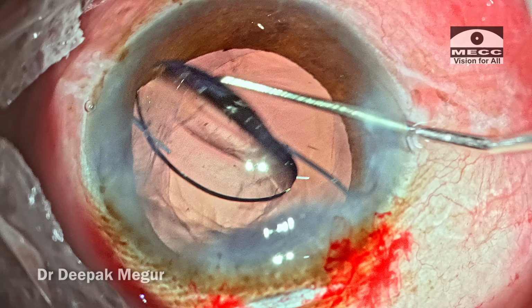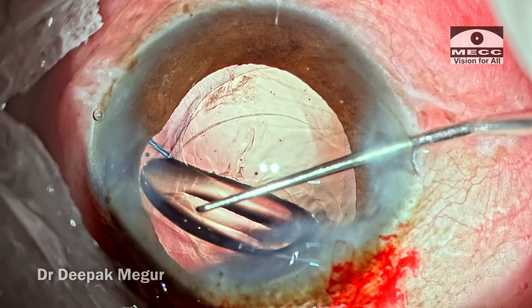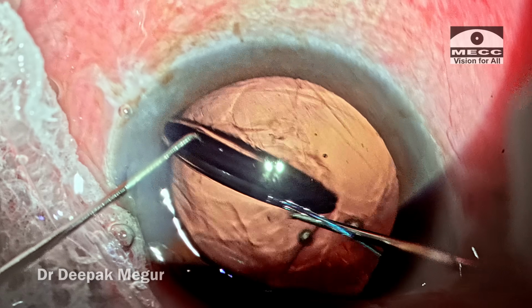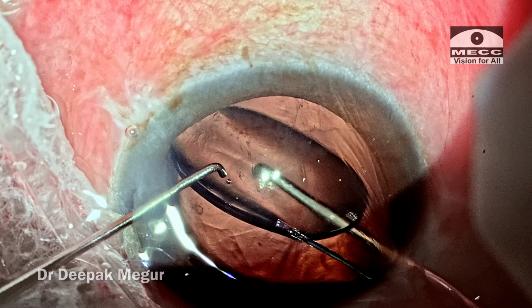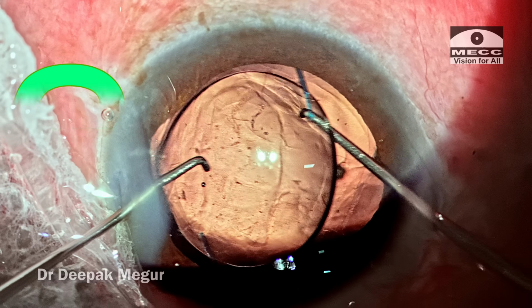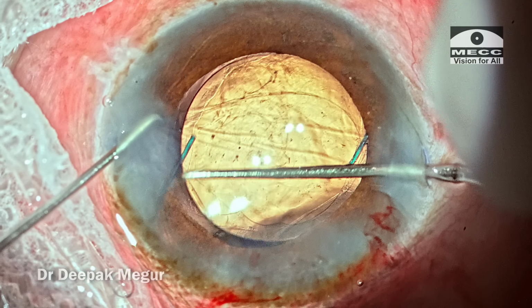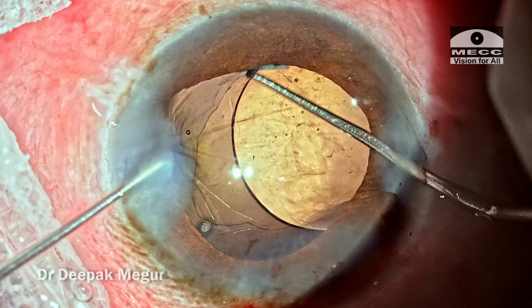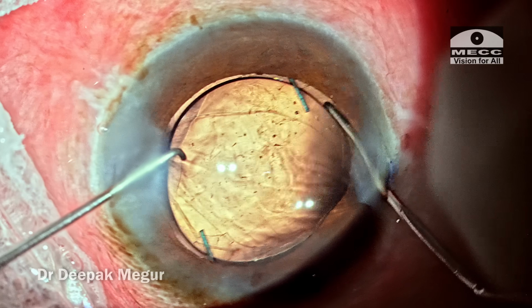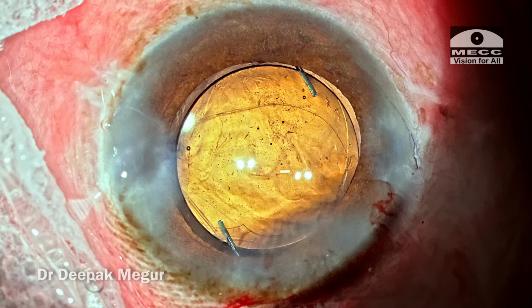It is difficult to flip it with a single instrument. I prefer to use 2 Sinskey hooks from either side ports, and this would help me to maneuver the lens or flip it back to its recommended orientation, that is the inverted S. The trailing haptic is then dialed into the sulcus, and now we have a multi-piece lens in the sulcus.